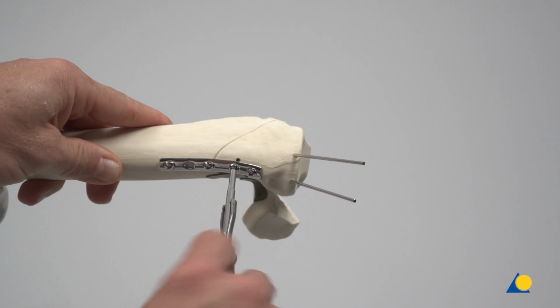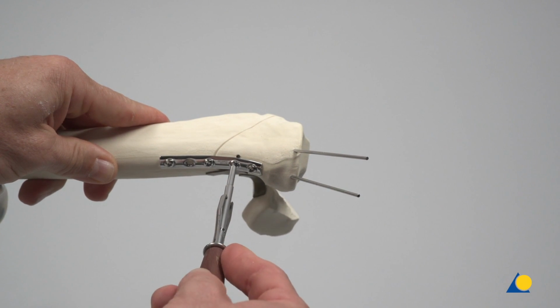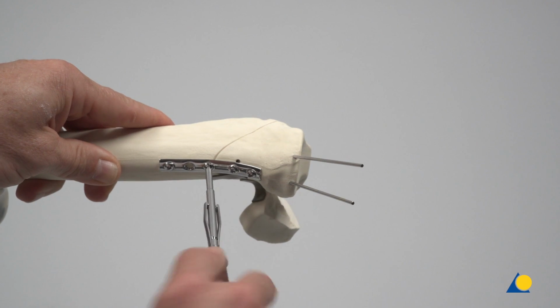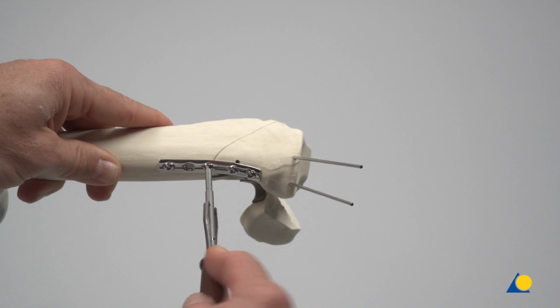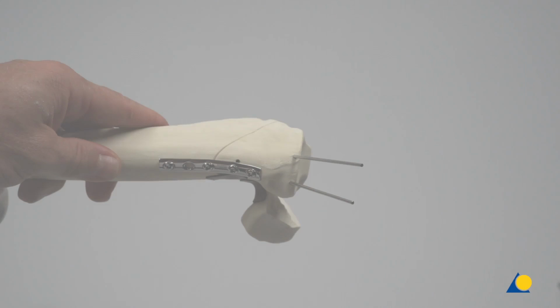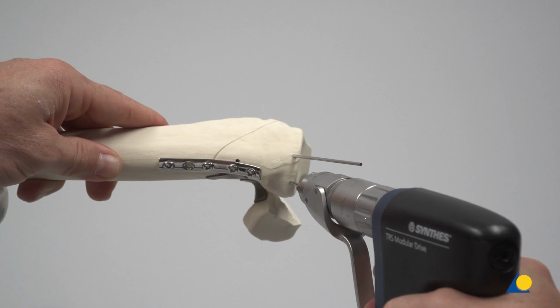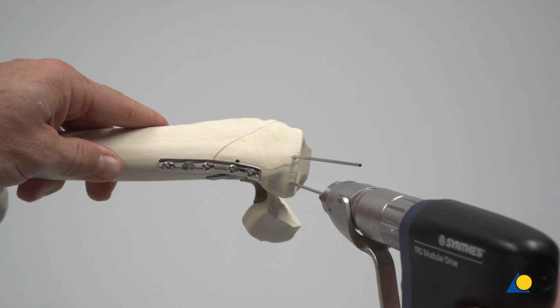To ensure they are fully seated, the screws are final tightened with clockwise turns of the hexagonal screwdriver. The K-wires are removed. At this point of the procedure, the screws could be exchanged for different lengths if necessary.